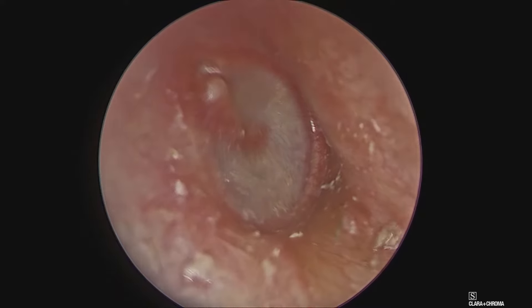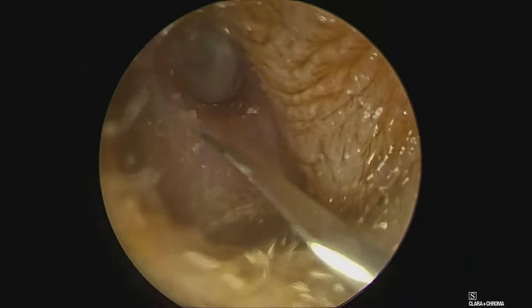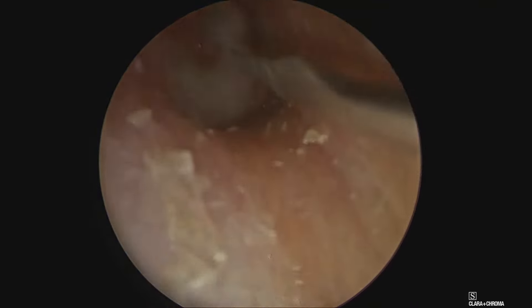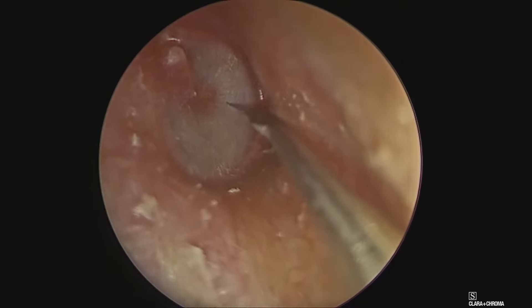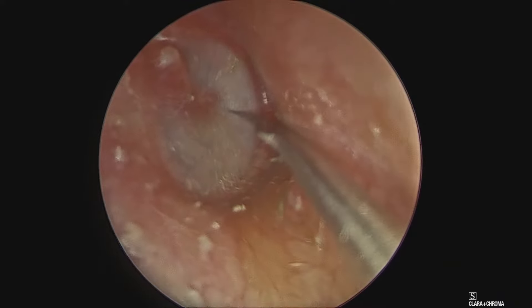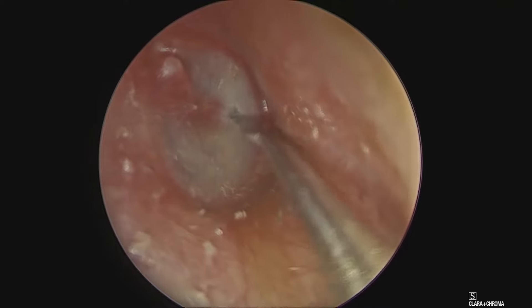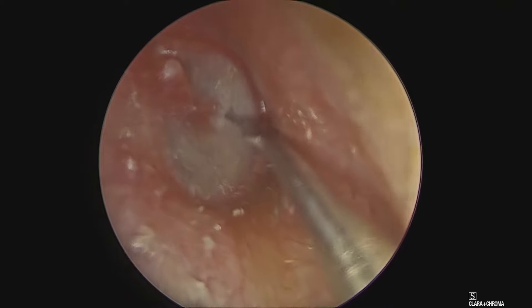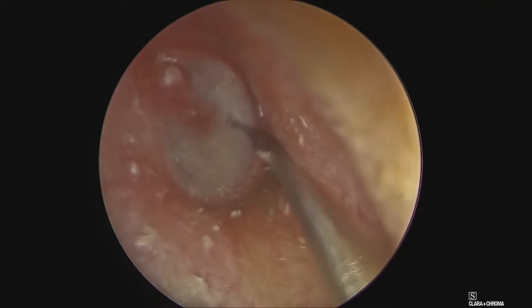Here we are seeing a zero-degree endoscopic picture of a right-side tympanic membrane and we plan to give a radial incision with the help of a sickle knife and then enter the inferior quadrant. The patient had more than 20 decibels AB gap for the last three months and a tympanogram showed a B-type curve on both sides.